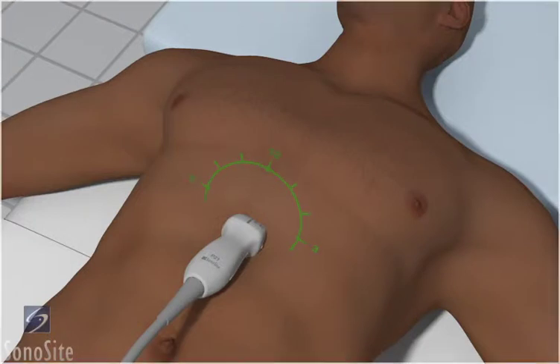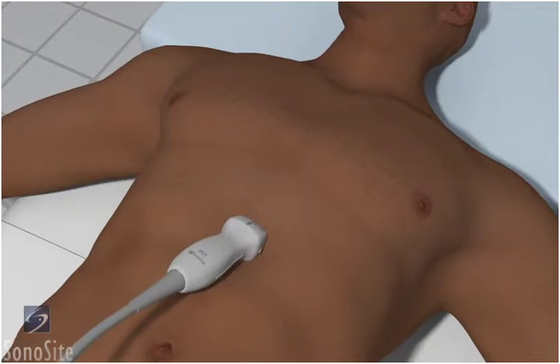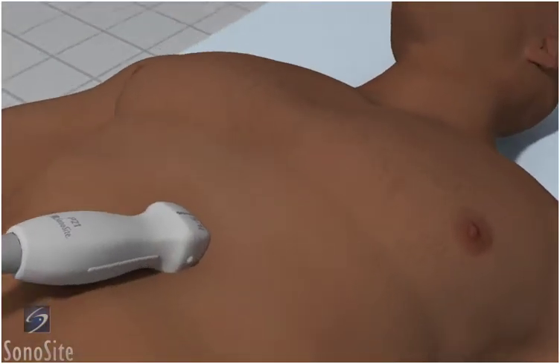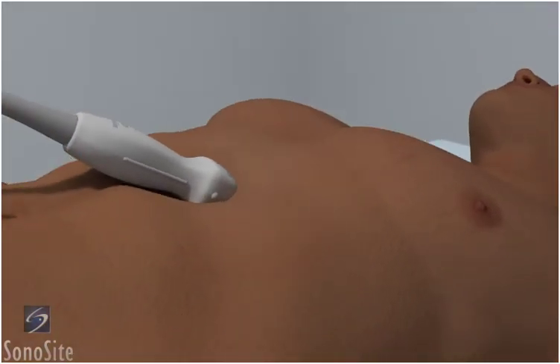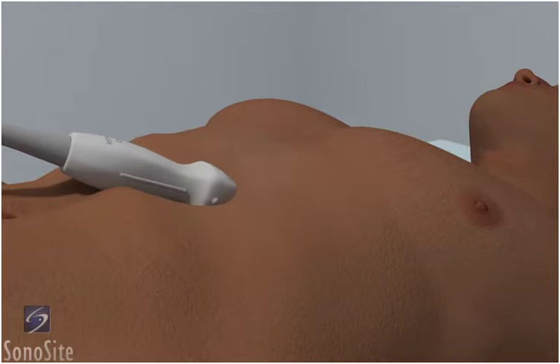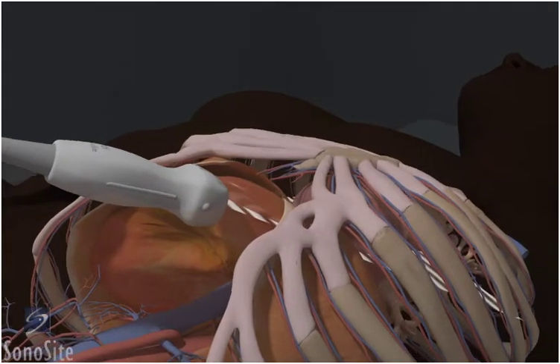This view uses the liver as an acoustic window to visualize the four chambers of the heart. Aim the transducer slightly toward the left shoulder with approximately a 15-degree angle to the chest wall. In some cases, the transducer is almost flat to the abdominal wall so the ultrasound beam is directed toward the left chest cavity. A considerable amount of ultrasound gel and downward pressure may be required to maintain contact of the transducer face with the abdominal wall.